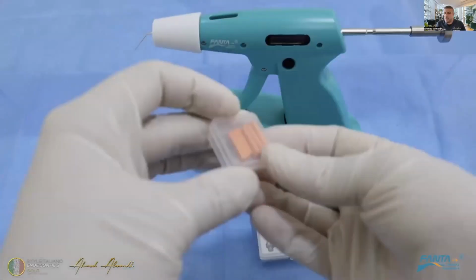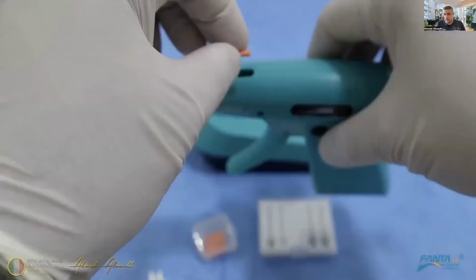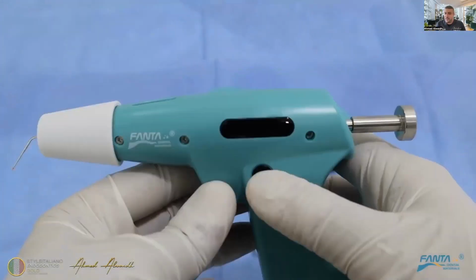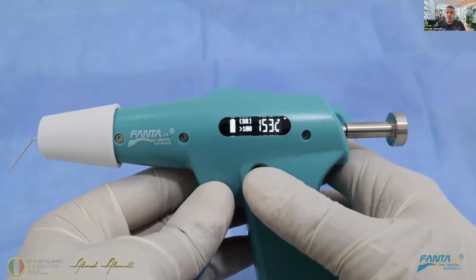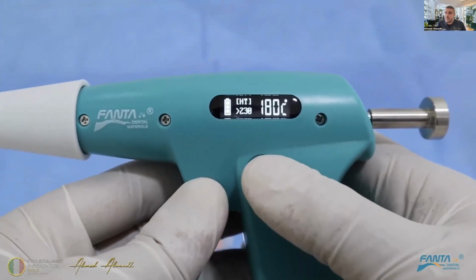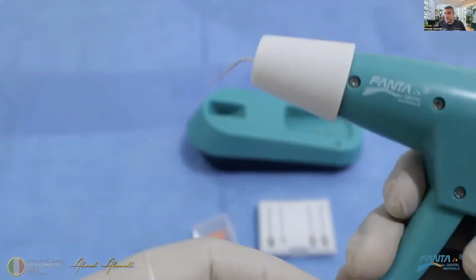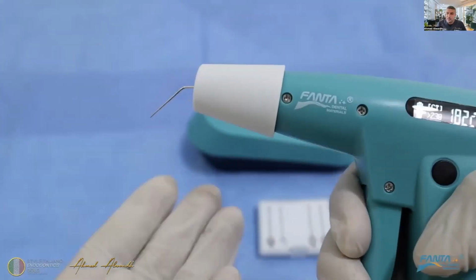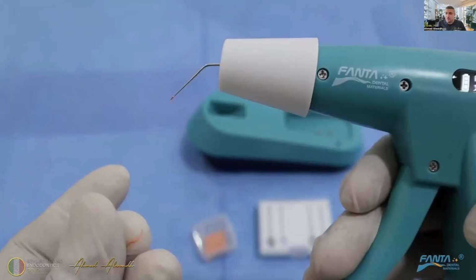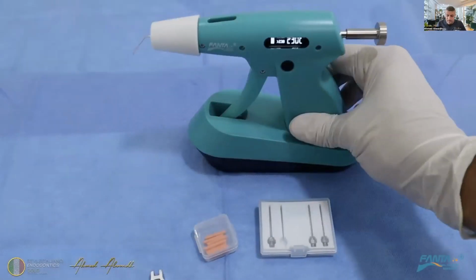And then we can load the gun with the GB bars, gutta-percha bars, which is a different type of gutta-percha, easily melted. Now the device is ready. Again, we have only one button. So long press on, long press off, and we press it to change the temperature. I usually like to work with high temperature, 230. And then we press the gun and we have the melted gutta-percha extruded easily from the device. Very nice tip. It can go deeper into the canal.